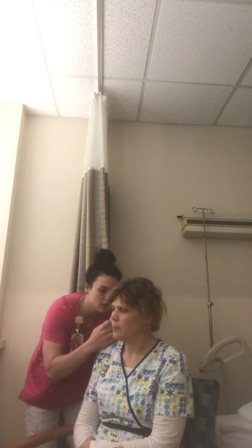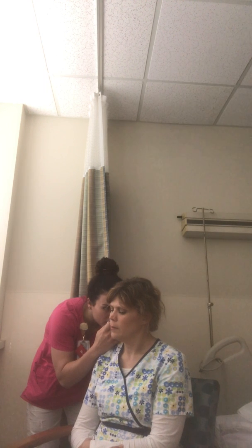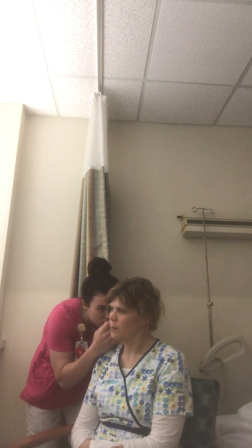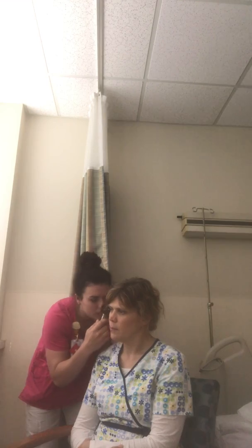We're going to pull up on the pinna and look inside the ear. Her auditory canal is pink and intact. There's no lesions noted. Her tympanic membrane is pearly gray. It's neutral. There's no bulging. There's no fluid noted. You can see the cone of light at 5 o'clock in her right ear. Okay, so we're going to move around to her left ear and do the same thing.